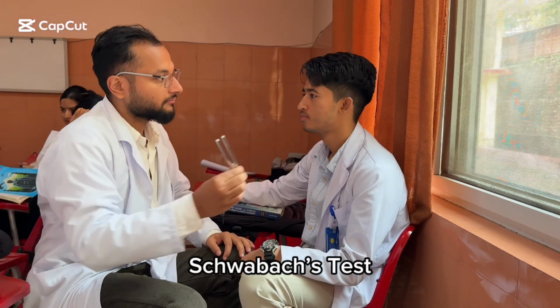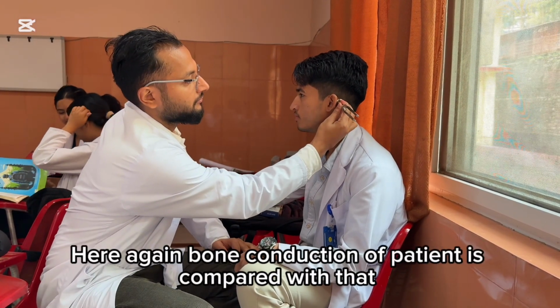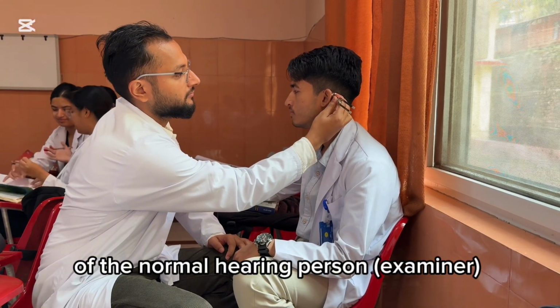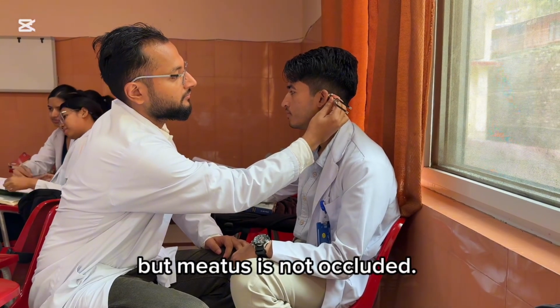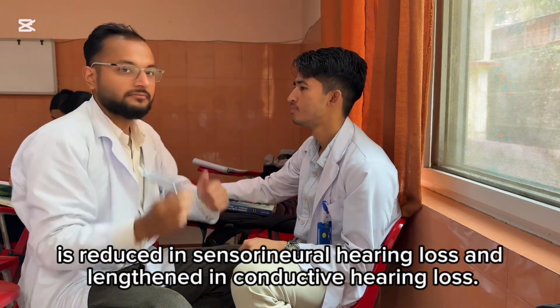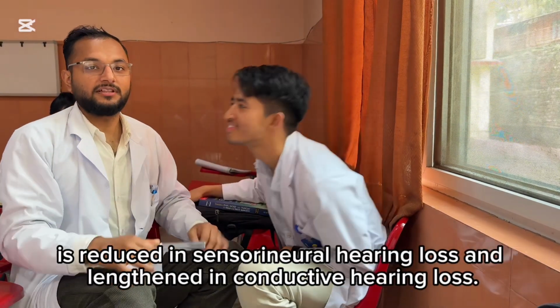Schwabach's test. Here again, bone conduction of patient is compared with that of the normal hearing person, examiner, but meatus is not occluded. Schwabach's test is reduced in sensory neural hearing loss and lengthened in conductive hearing loss.